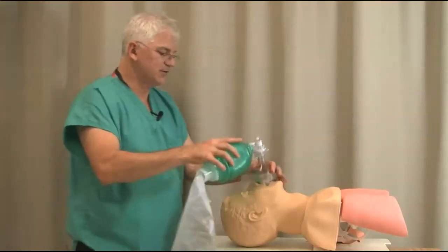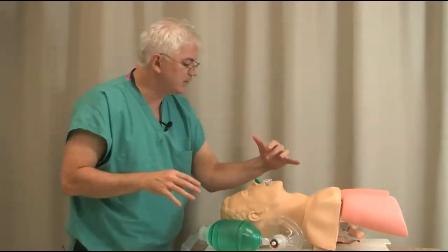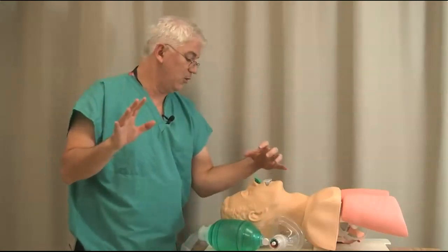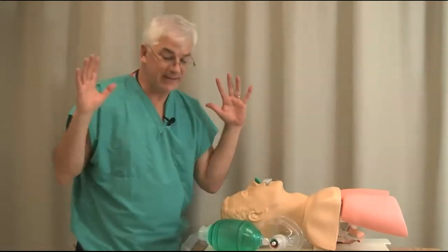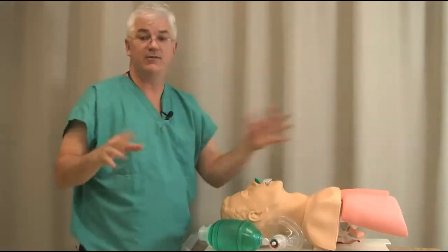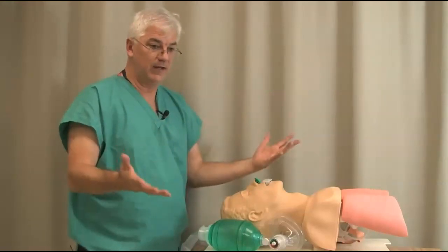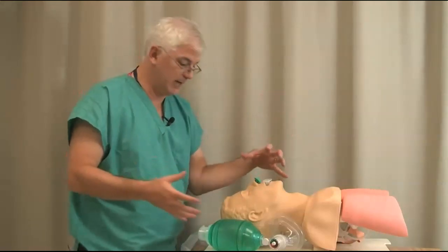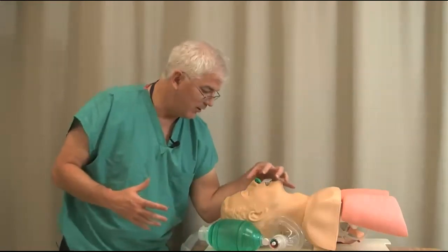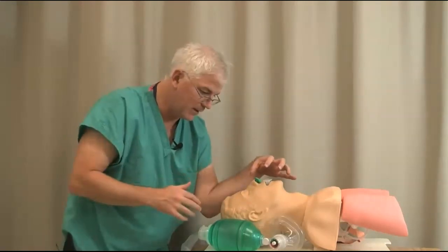Now, I'm going to focus on my left arm. Let's say we encounter a situation where we really can't intubate, and we have to mask for a long time. Maybe you've graduated and you're at a facility. There's no anesthesia person readily available, no fiber optic. You have to mask for a long time. If you mask like this, I don't care how good a shape you're in, your arms are going to get tired, with this kind of claw-like grip.